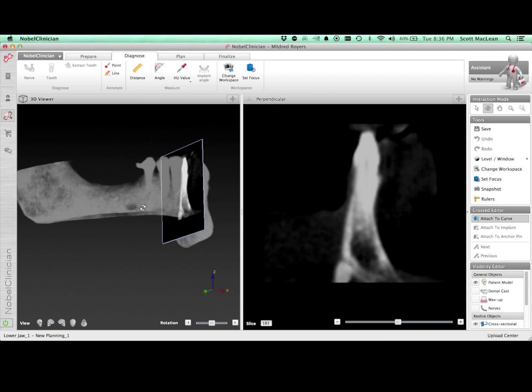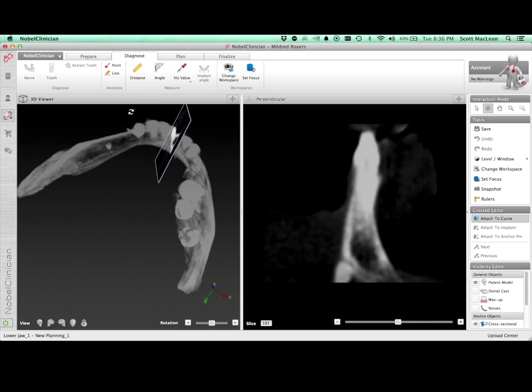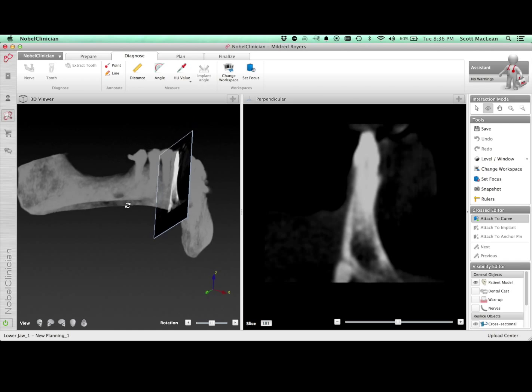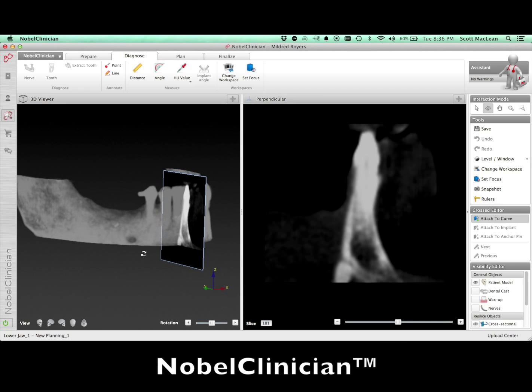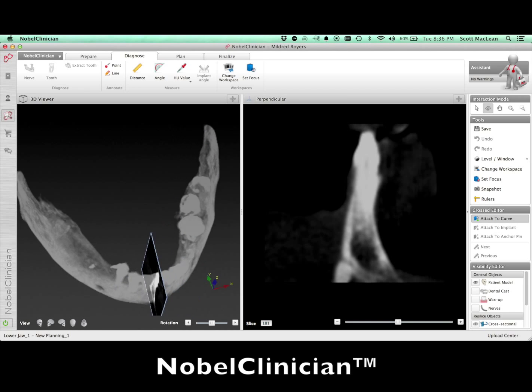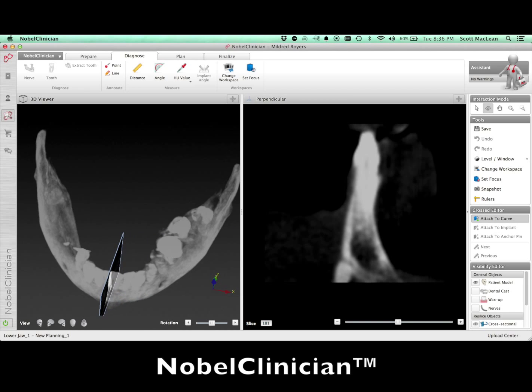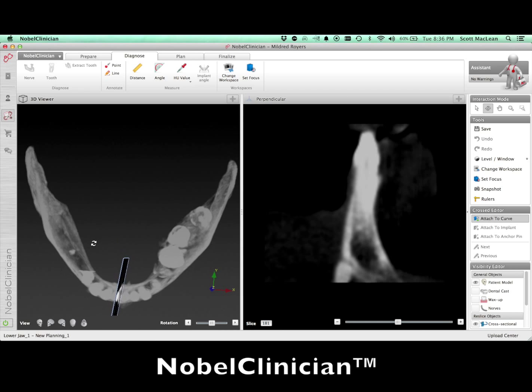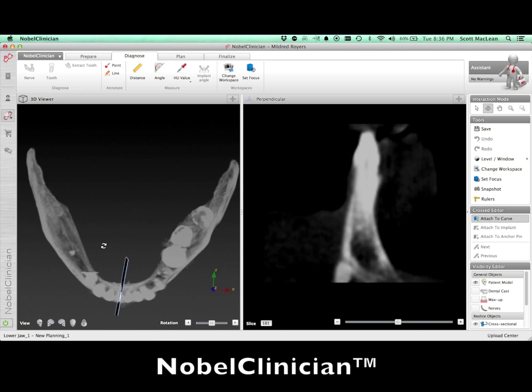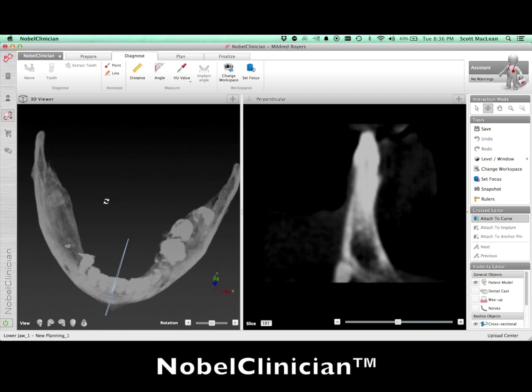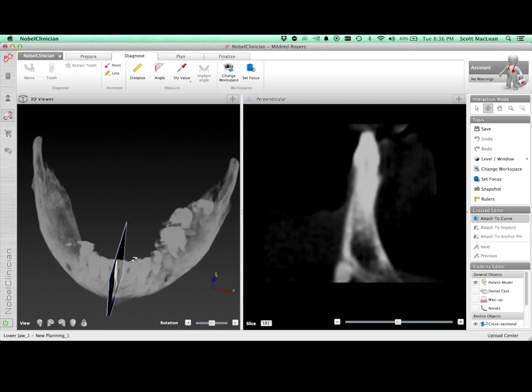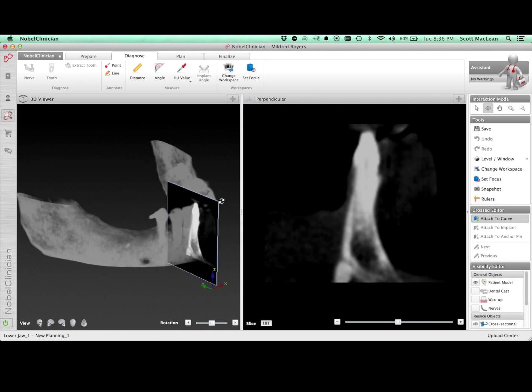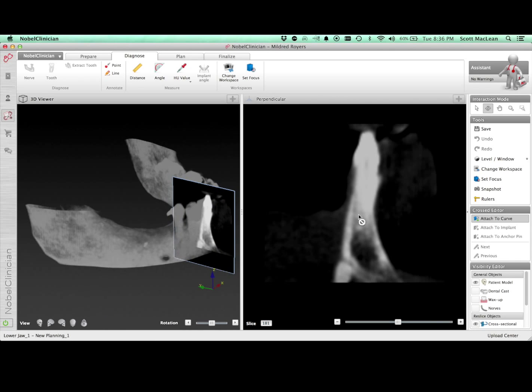You can see here this particular bone model which is being shown in Nobel Clinician, which is a 3D software. You can look at it in a number of different softwares. What we'll look at is how the bone looks. Now one of the goals is to place these implants in a position that's going to be good for the final prosthesis.